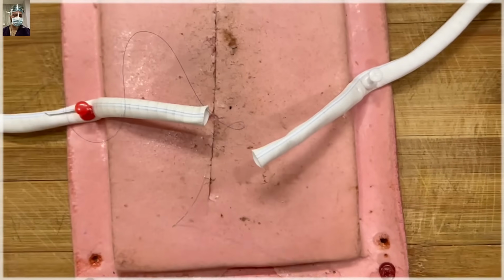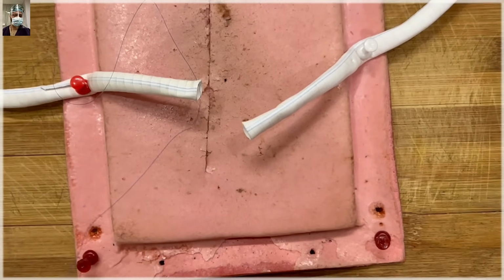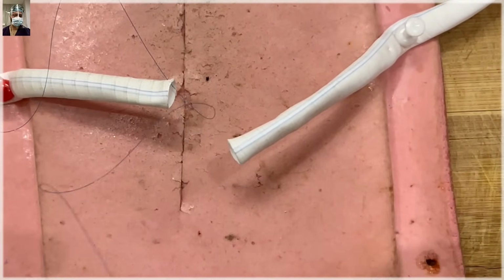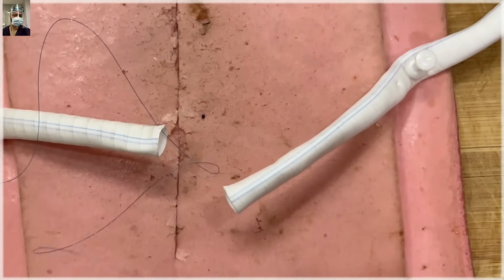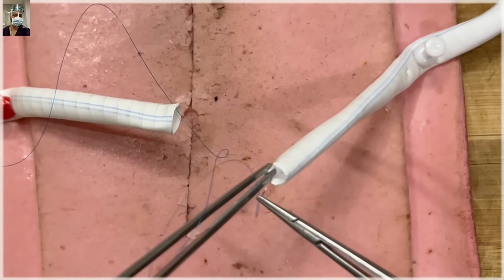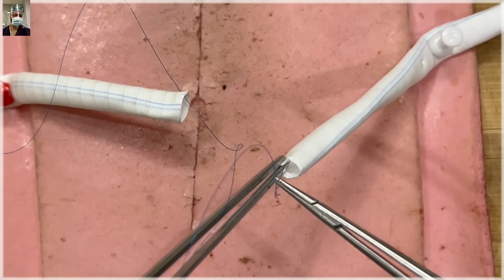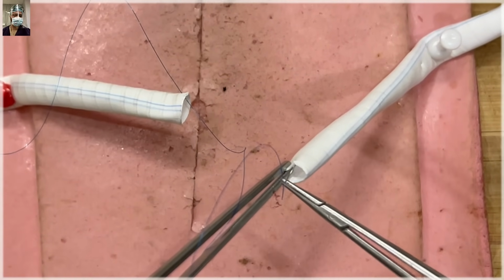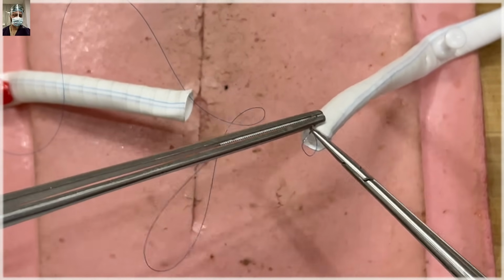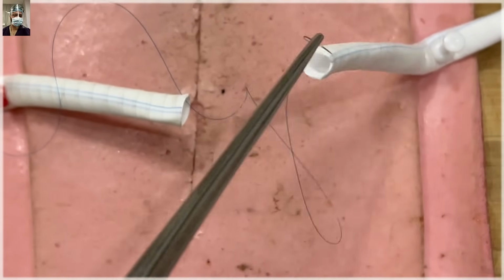So this will be the 6 o'clock suture. Always hold the adventitia, never hold the intima. Here I have relatively fixed the artery, so the manipulation may be difficult, and I'm doing it alone, so there is no expert assistance available. In real life, you will have good assistance and you may be able to do it with a little bit more ease.